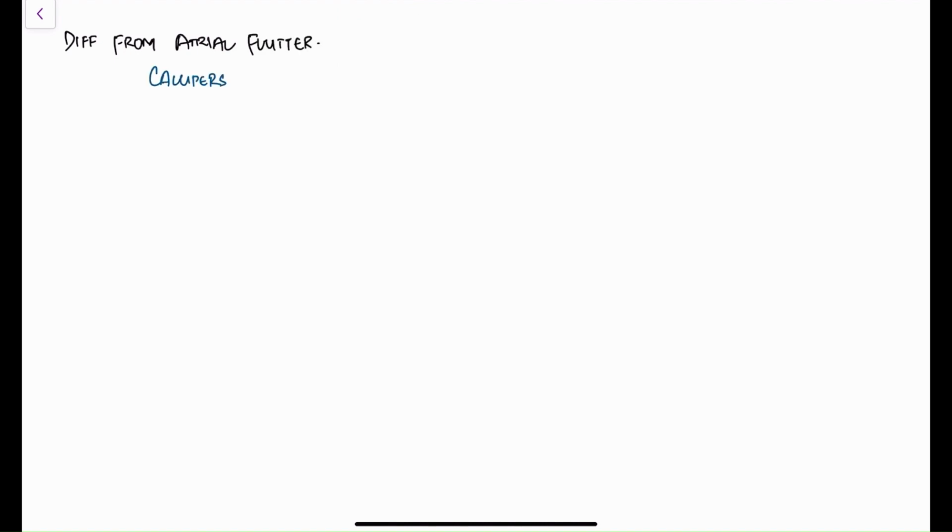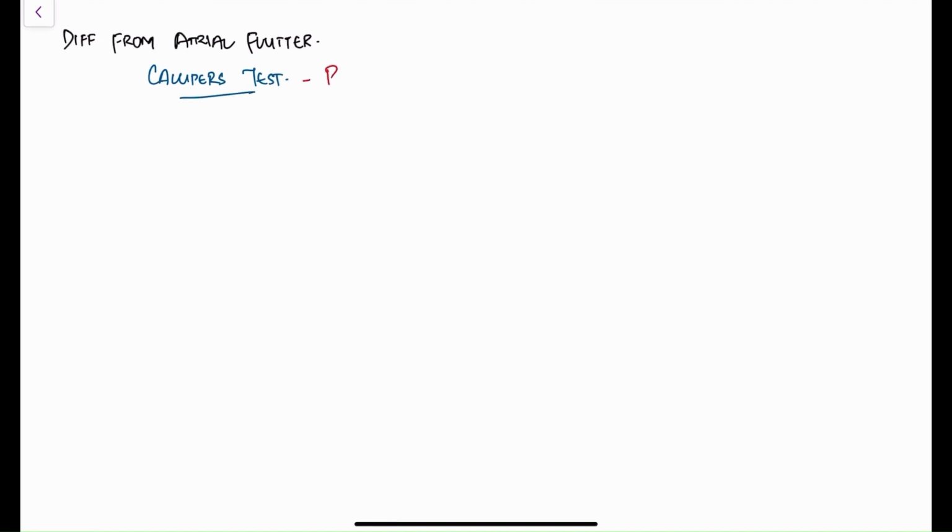You can differentiate atrial fibrillation from atrial flutter by using the calipers test. We will take a look at an ECG later so we can practice this.